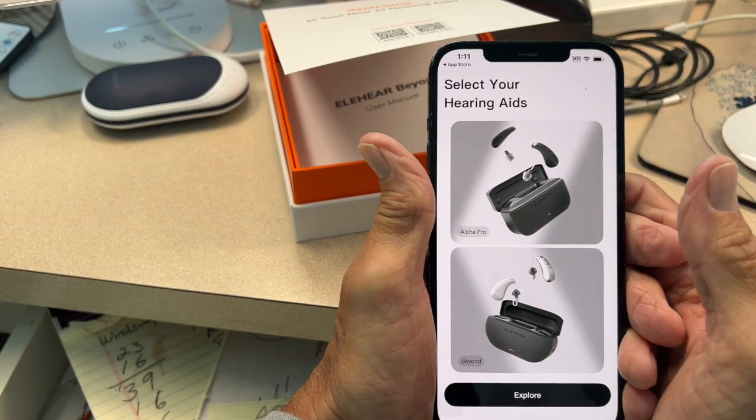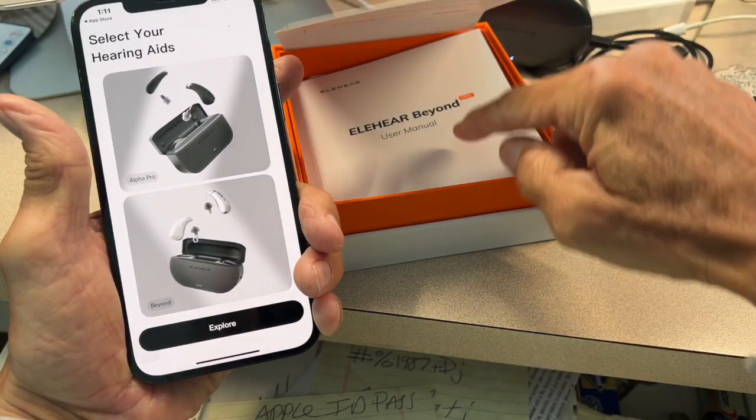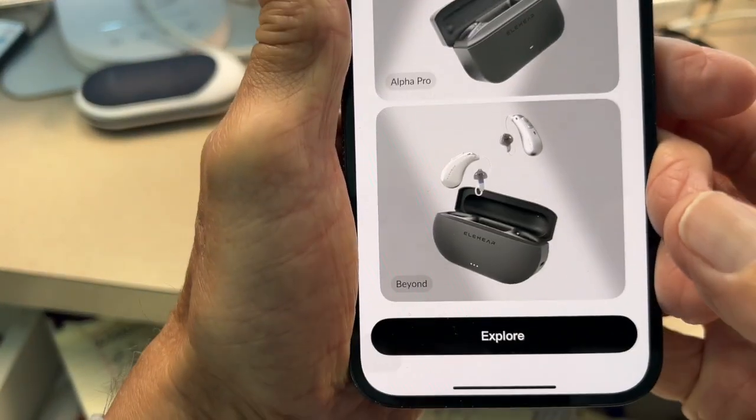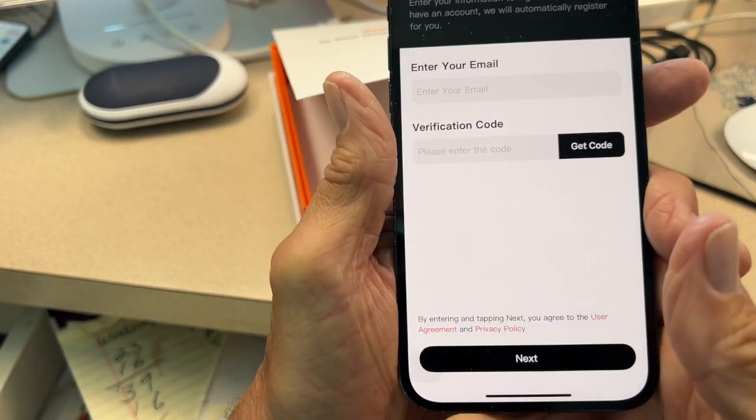So now we got to figure out which ones we got. And if I look on here, you're going to see it says Beyond, right? So there's two of them. There's Alpha Pro and there's Beyond. So I got to click Beyond. All right. Now it's going to send.